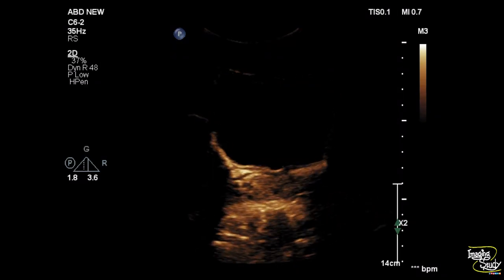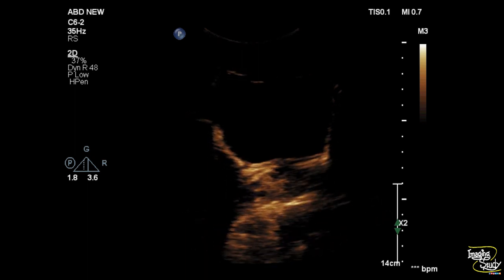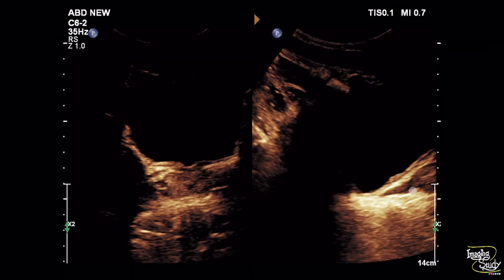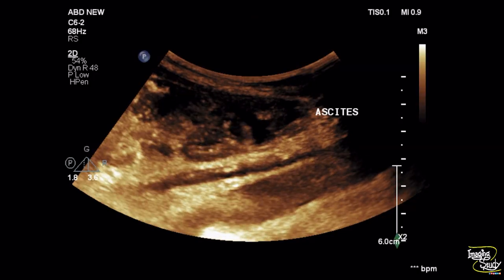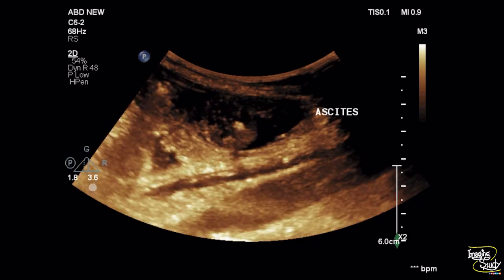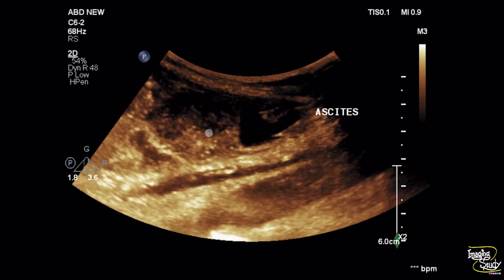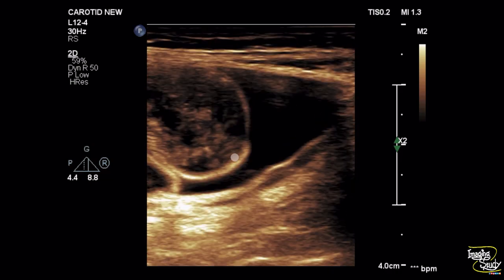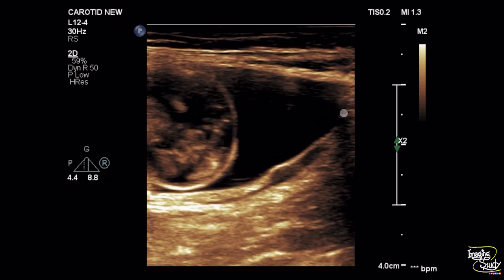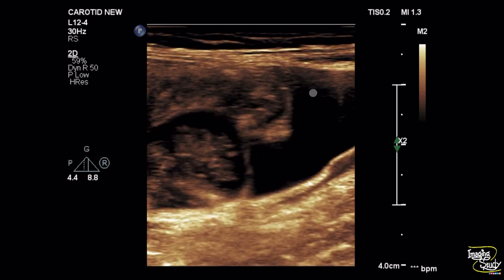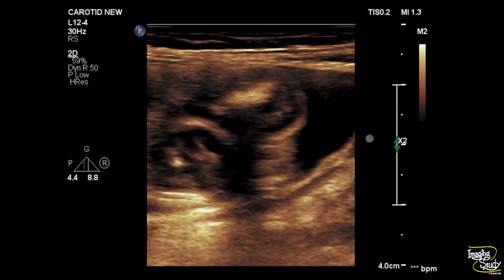The urinary bladder looks normal and the prostate, as this is a male patient, also looks normal. We want to focus on the iliac fossa because we have seen some collection at Morrison's pouch. At the right iliac fossa you can see the bowel loops moving due to peristaltic movement, and you can see an anechoic area outside the intestinal loops indicating a small amount of ascites — a very common dependent site.